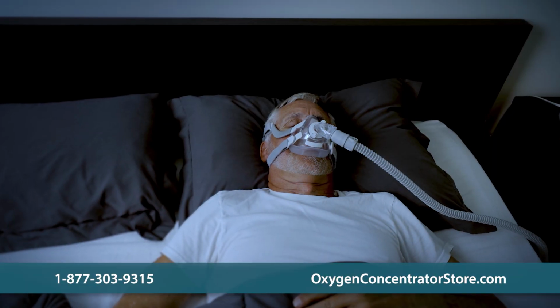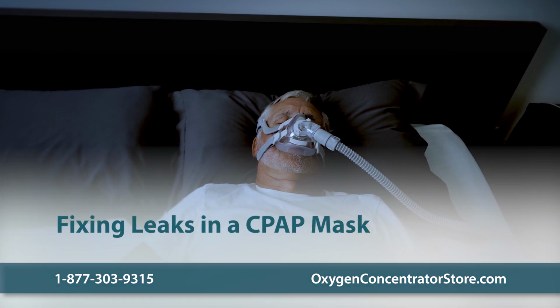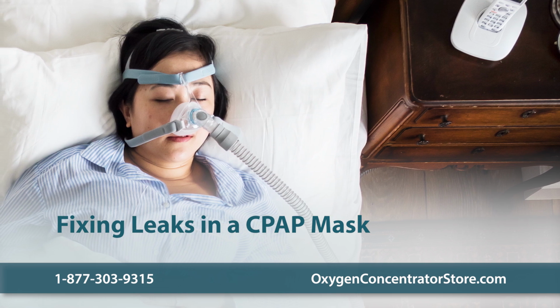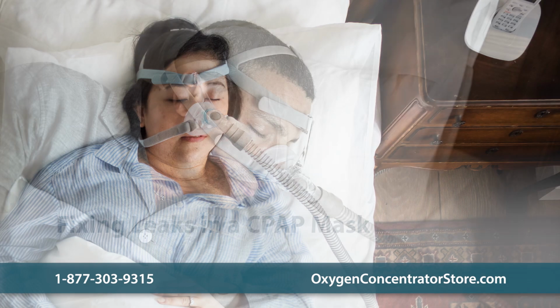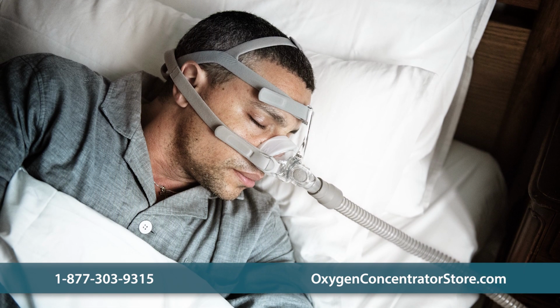If you use a CPAP machine for sleep apnea, a leaky CPAP mask can seriously affect your therapy. If air is escaping from your mask, you may not receive the proper air pressure needed to keep your airways open and treat your condition. A leak can also cause your airways to dry out, irritate eyes, and disrupt sleep.